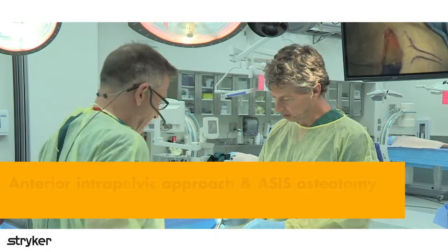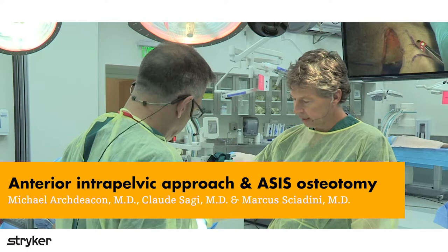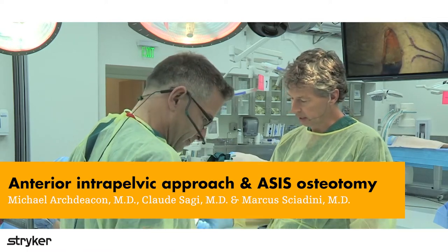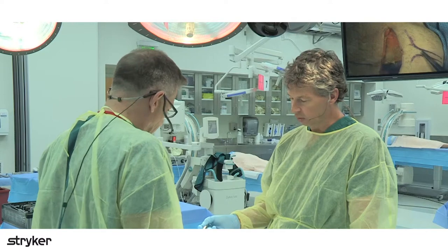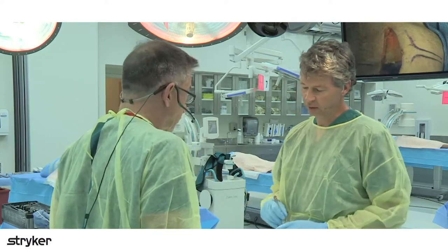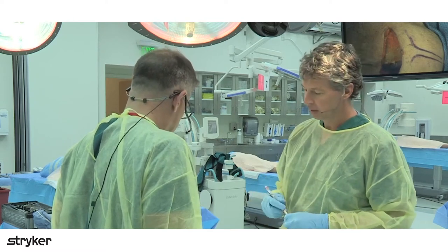Well, if everyone is all set to go here, this is just a little prelude to the cadaver portion of this little get-together. Marcus Sciadini and I are going to go through and try to show the various techniques and the things that you can do to enhance the exposure when you're doing an anterior intra-pelvic approach.